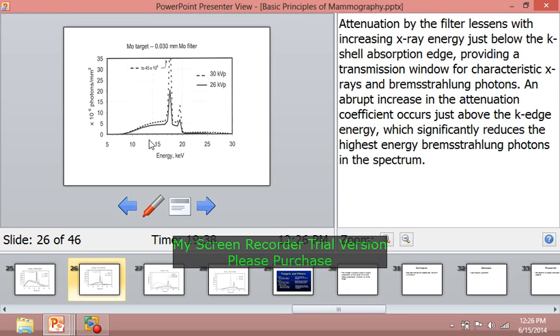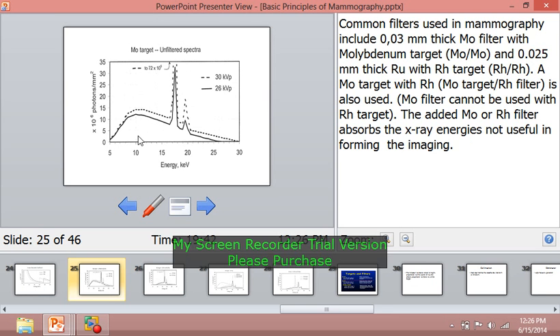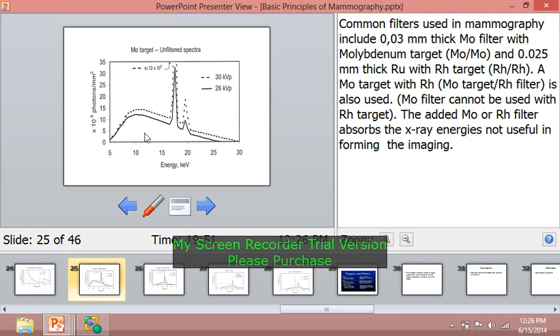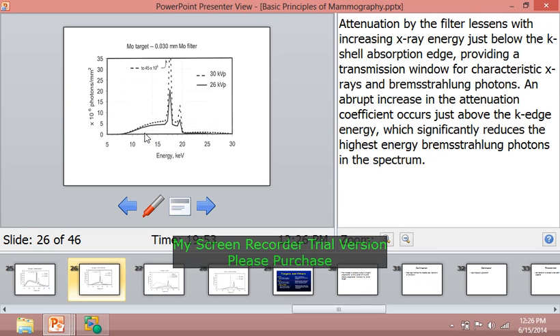So here this undesired radiation is now filtered. Here we do not see such a half-circle type. So the area under this curve is reduced. That means it is the filtered one.